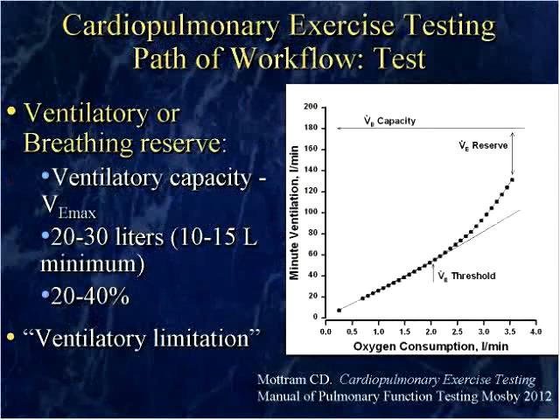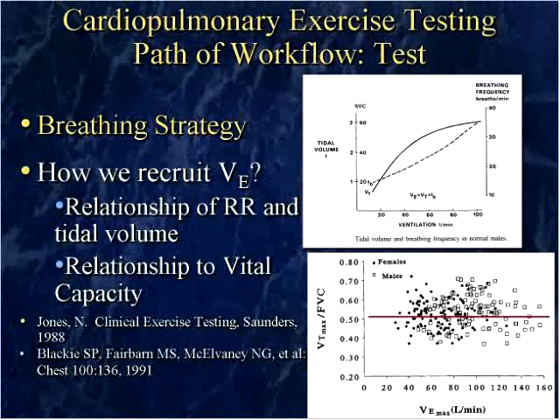We really don't have all the time right now to get into this, but if someone is reaching their ventilatory capacity so that they're defined as ventilatory limited, that may be the key that they've reached a maximum test. And so it's good to know those things on the front end.